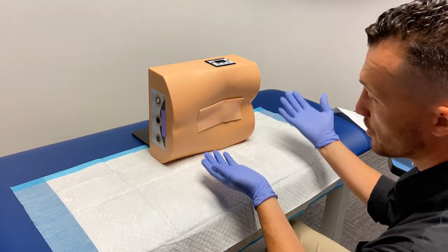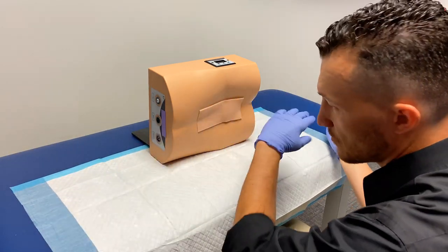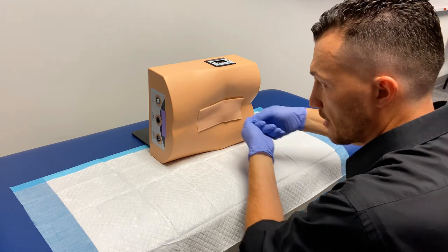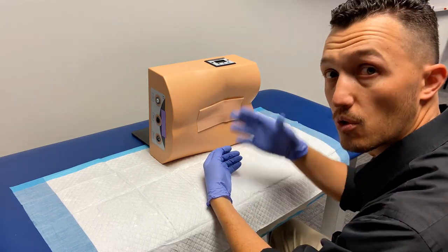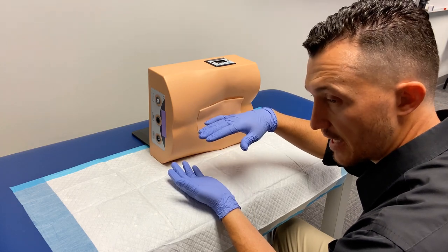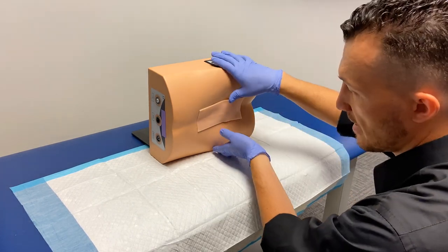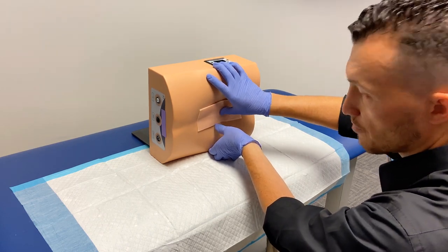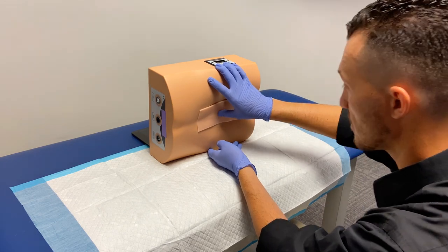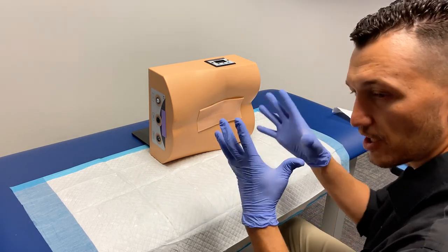If we're measuring opening pressure, we want the patient lying on their side — that will be the majority of the time. The patient is laid on their side with buttocks here and head in the other direction; either right or left side is okay. I generally do it with the patient's head to my left because I'm right-handed and have better control that way. I generally put a Chuck's pad under the patient. You'd palpate around feeling for the spinous processes — finding the L4 or L5 spinous process and the space between them.